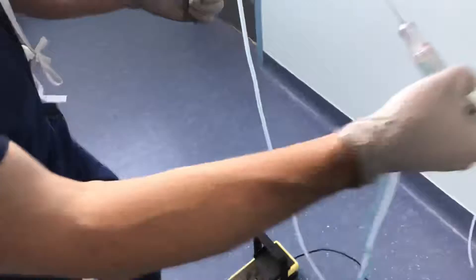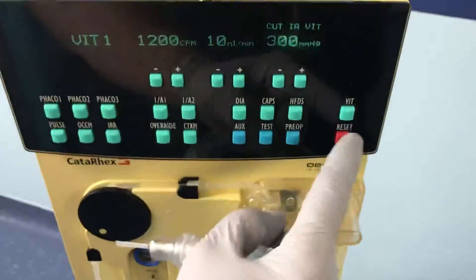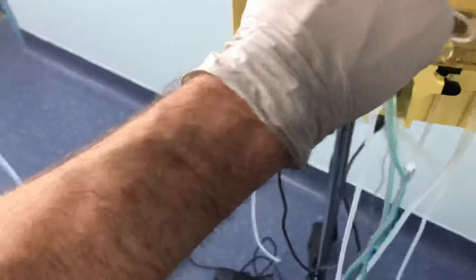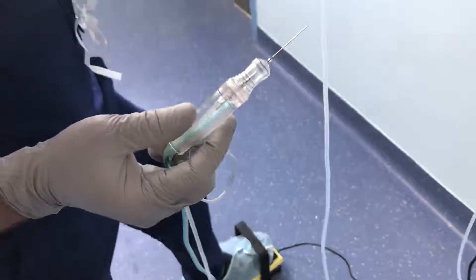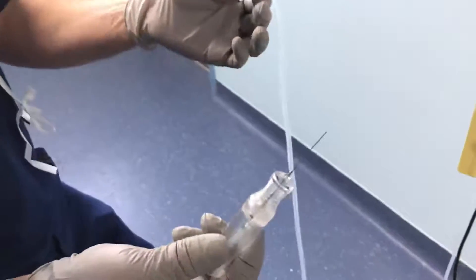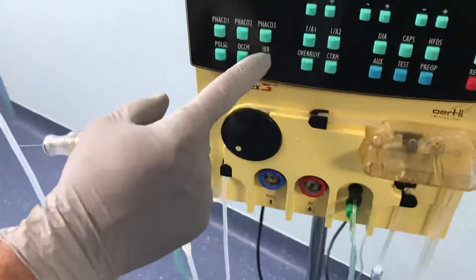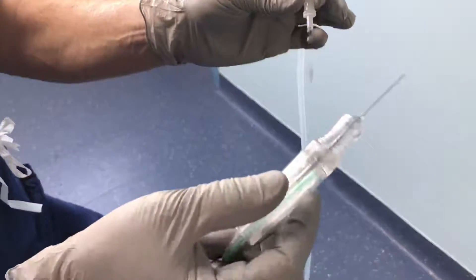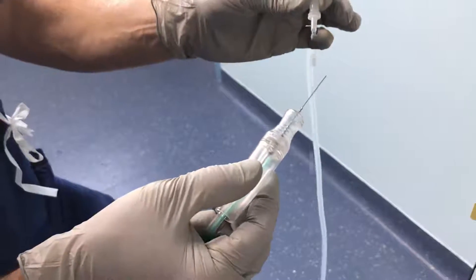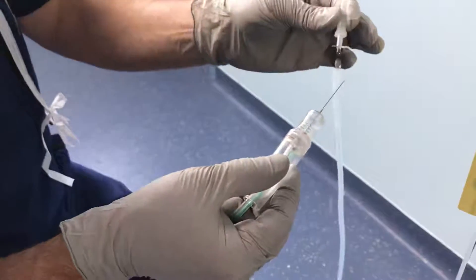On the foot pedal, we have to hit vitrectomy — the vitrectomy button right there. So now it's on vitrectomy settings with a 1200 cut rate. The special thing is the irrigation: with my Simcoe here irrigating, you want to hit the constant irrigation button. So now it's constantly irrigating in the eye. When I push further, it starts to cut, and if I floor it, it starts aspirating. So it's: irrigate, cut, aspirate when you floor it.